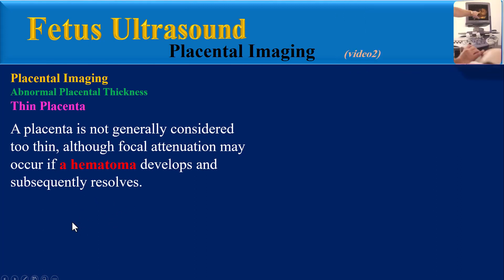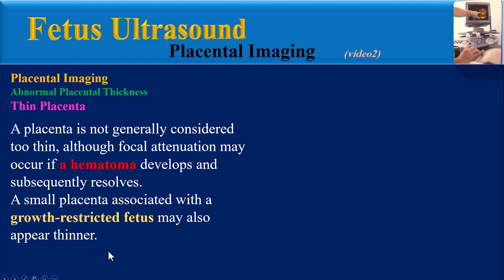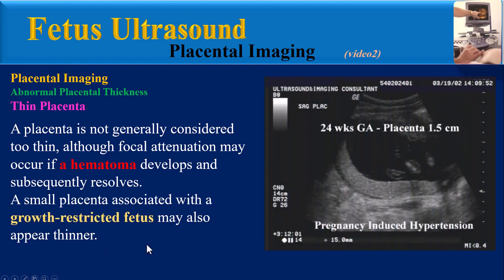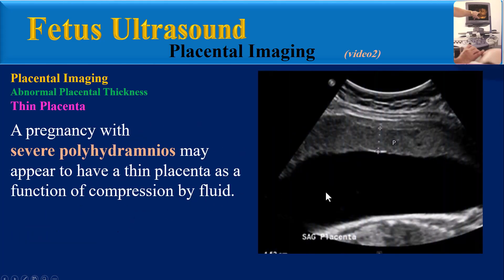A placenta is not generally considered too thin, although focal attenuation may occur if a hematoma develops and subsequently resolves. A small placenta associated with a growth-restricted fetus may also appear thinner — as seen in this ultrasound image showing pregnancy-induced hypertension and a thin placenta at 24 weeks gestation. A pregnancy with severe polyhydramnios may appear to have a thin placenta as a function of compression by fluid. This ultrasound image at 30 weeks gestation with polyhydramnios shows a thin placenta measuring 1.5 cm.